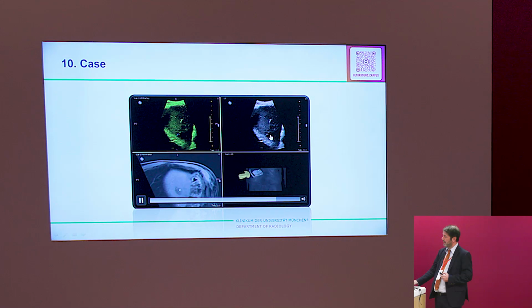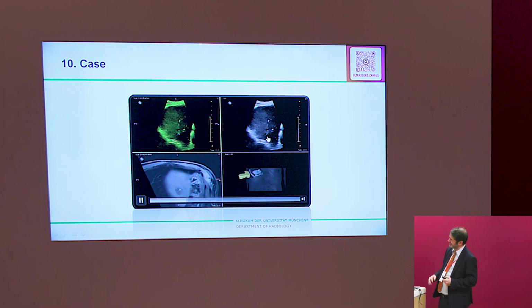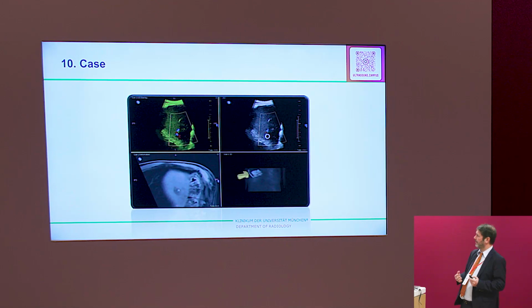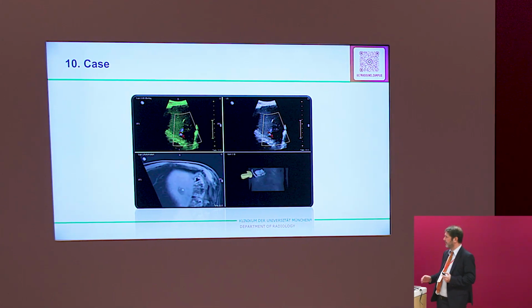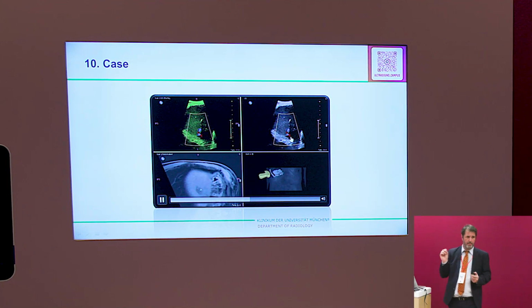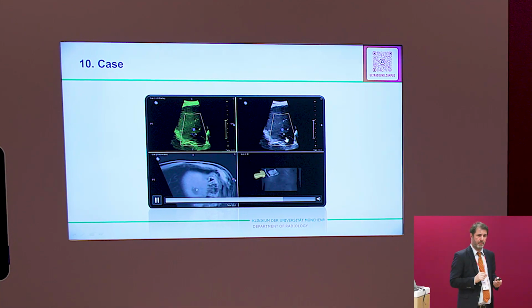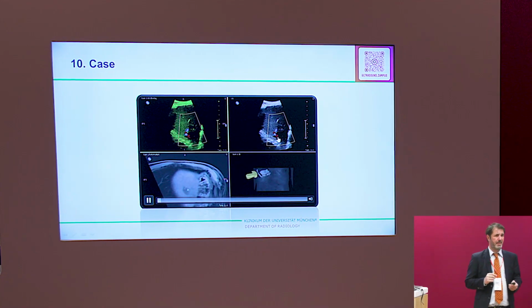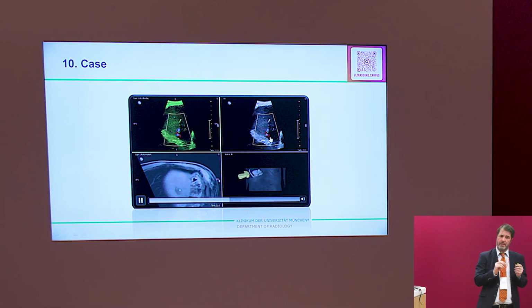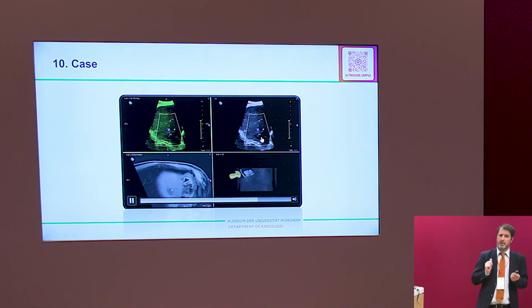We see there's a lesion. It doesn't look like really a solid lesion. And look here. We could see a lot of flow. You see these blue and red areas? This is very atypical, because if you have a small met, you see only very tiny vessels, not such big ones. So something is wrong.